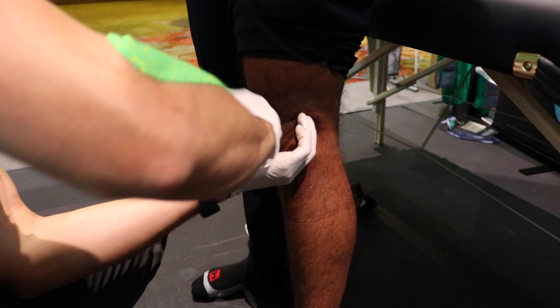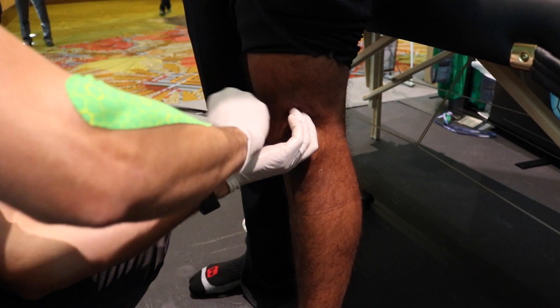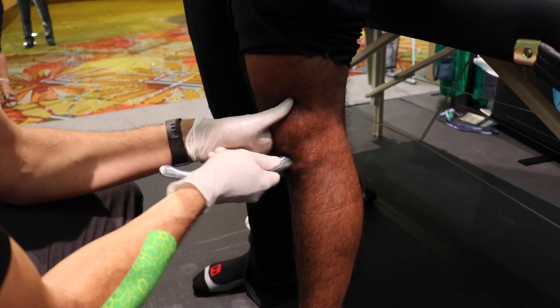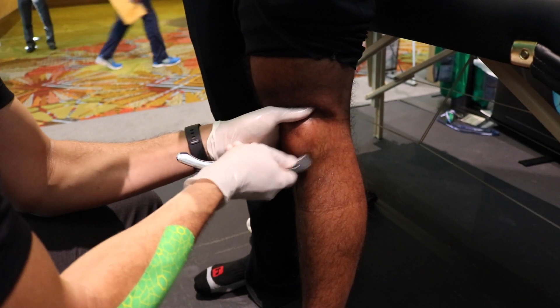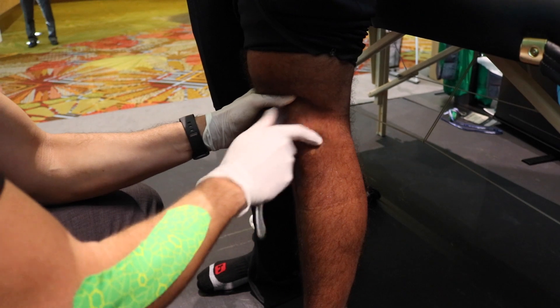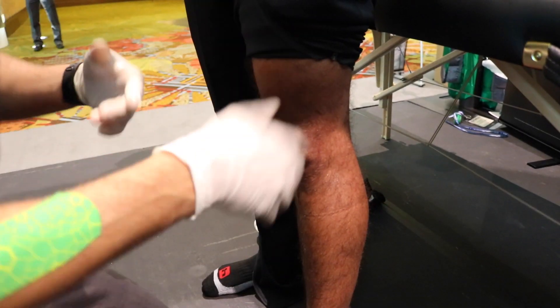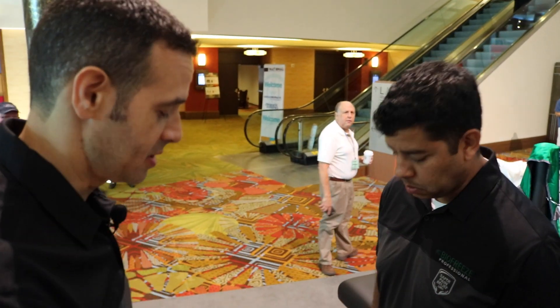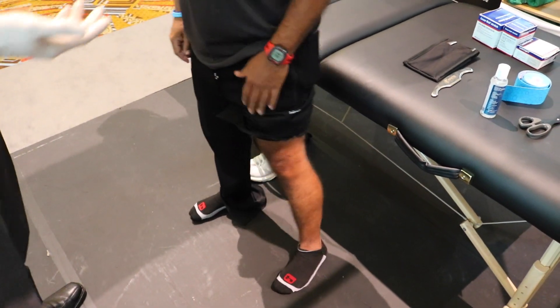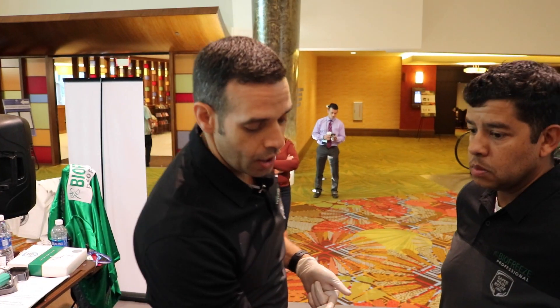Then we can come over to the other side and do the same thing — right around the patellar retinaculum on the medial side. We don't have to be pro-inflammatory here because we're not doing a patellar tendinopathy, so we're just going to come right around that inferior area, taking skin tension up and right around that superior pole as well. That in itself usually gives a gentle loosening up of the knee. If he goes into a squat he'll probably notice the knee feels a little easier during movement. The way I've always done it in practice is: if you had a 10 on your initial provocation test, what is it now? We're looking for a minimum of 50% reduction in symptoms. If it doesn't reach 50%, I might retreat to see if there are other areas I missed or where symptoms may have shifted.